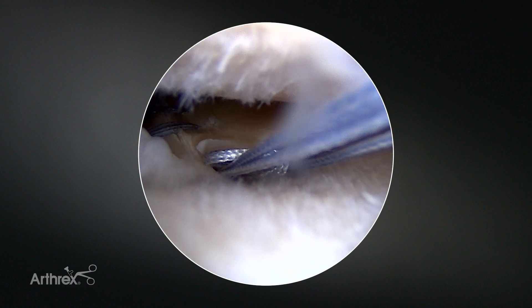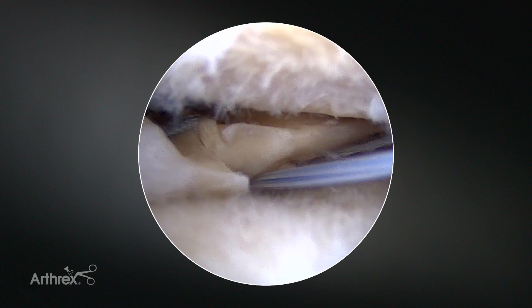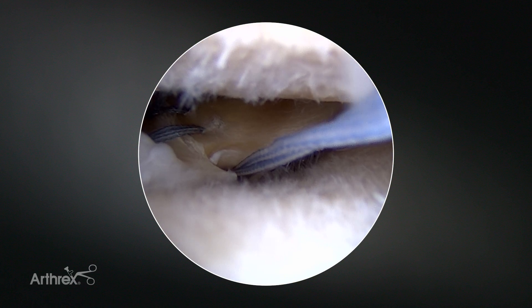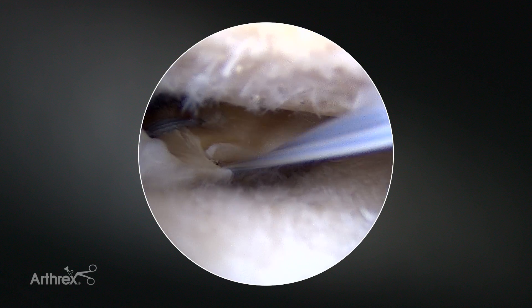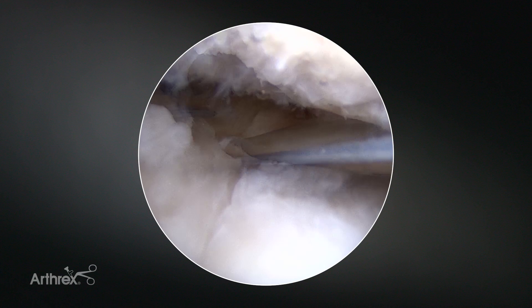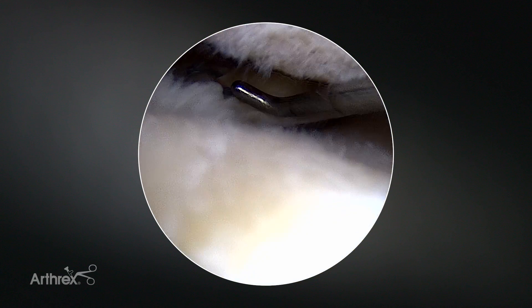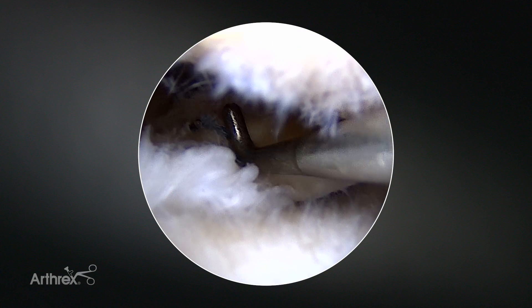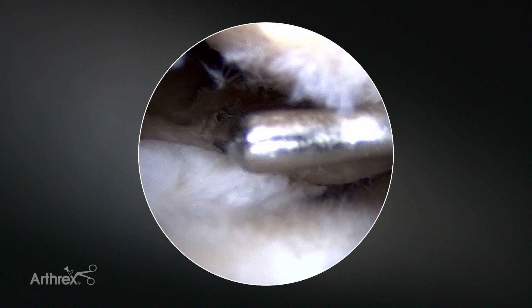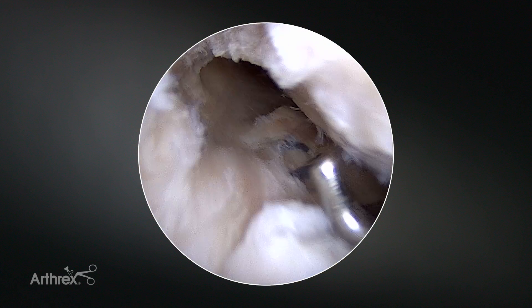You don't really see it as well. See how that kind of pulled it down and reduced that tear. The suture that grasped the capsule does a very good job grasping. You can see the tear — we've approximated it side by side, we've reduced it up and down. You could still add more suture across, or add vertical mattress-type sutures here to stabilize both sides of this.